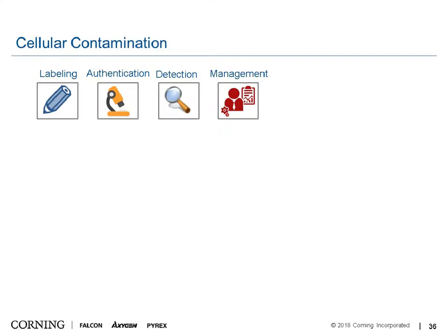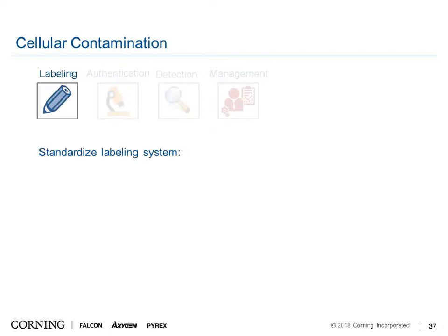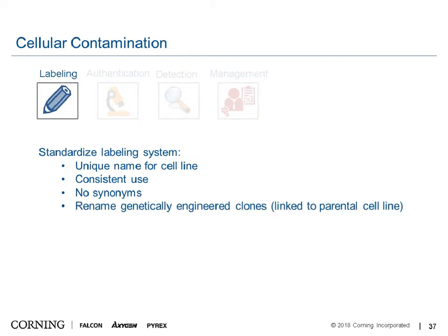How do you prevent or manage cellular contamination? It's very important to start with a proper labeling system so that cells are labeled correctly and you don't mistake one cell line for another. Ideally the whole lab or department would have a standardized label system. Some tips: start with a unique name for each cell line and use it consistently — don't make synonyms or abbreviations once it's established. Rename genetically engineered clones and try to link them to the parental cell line.